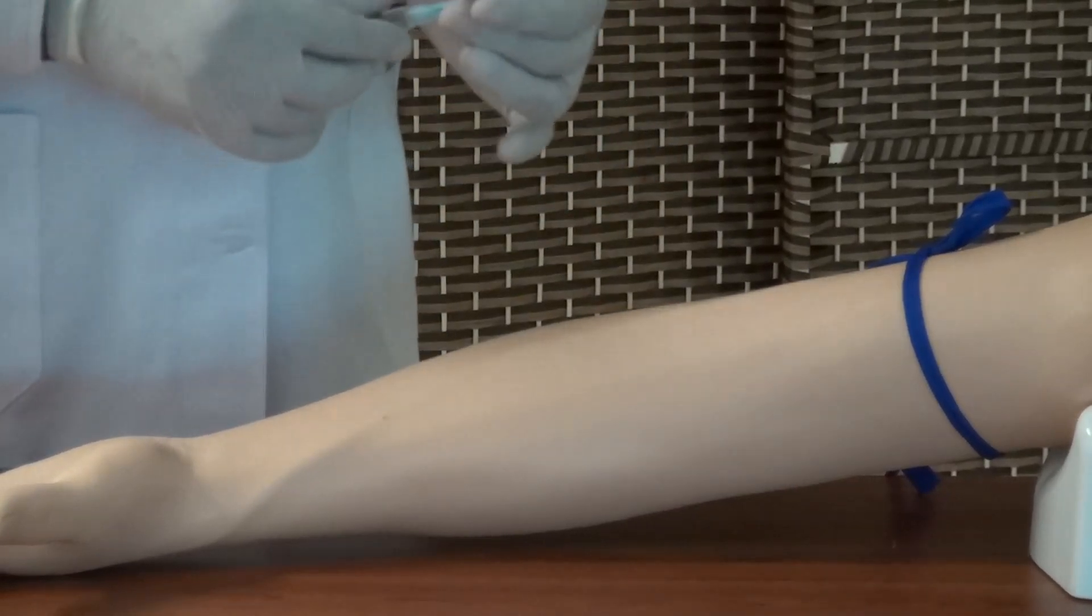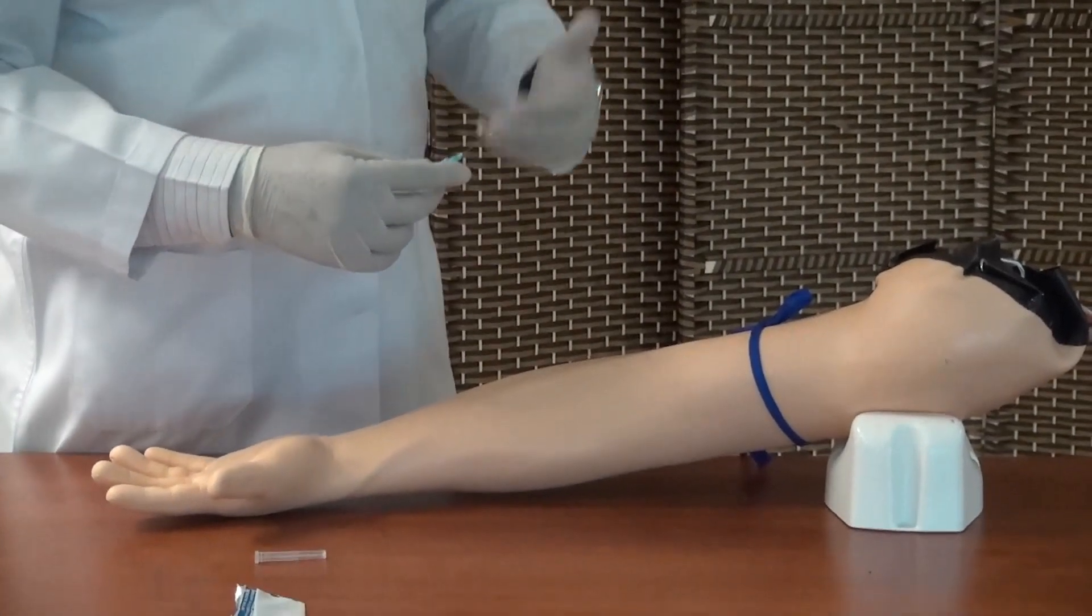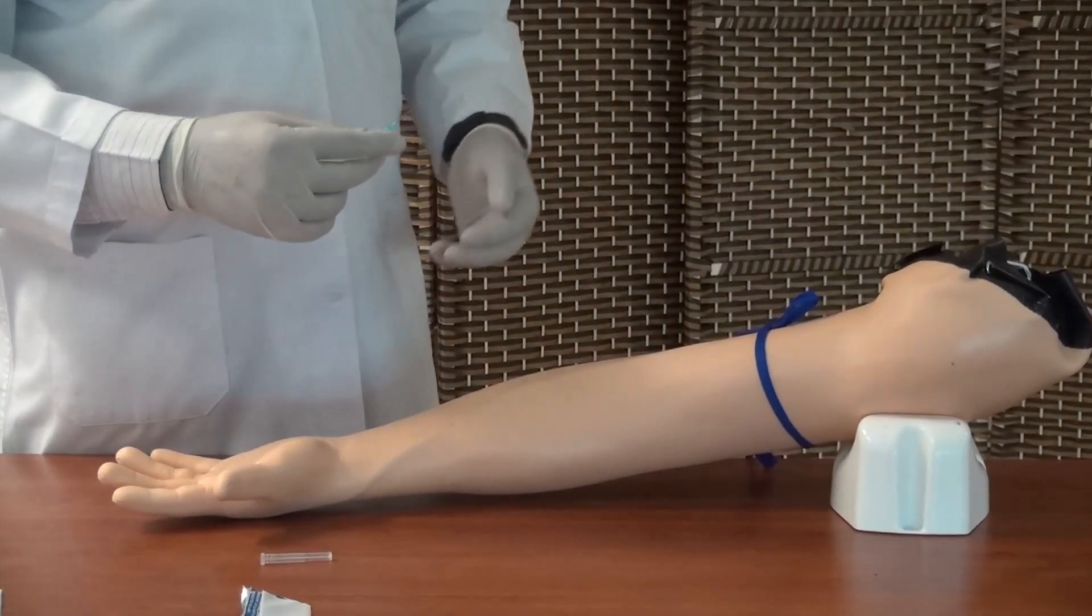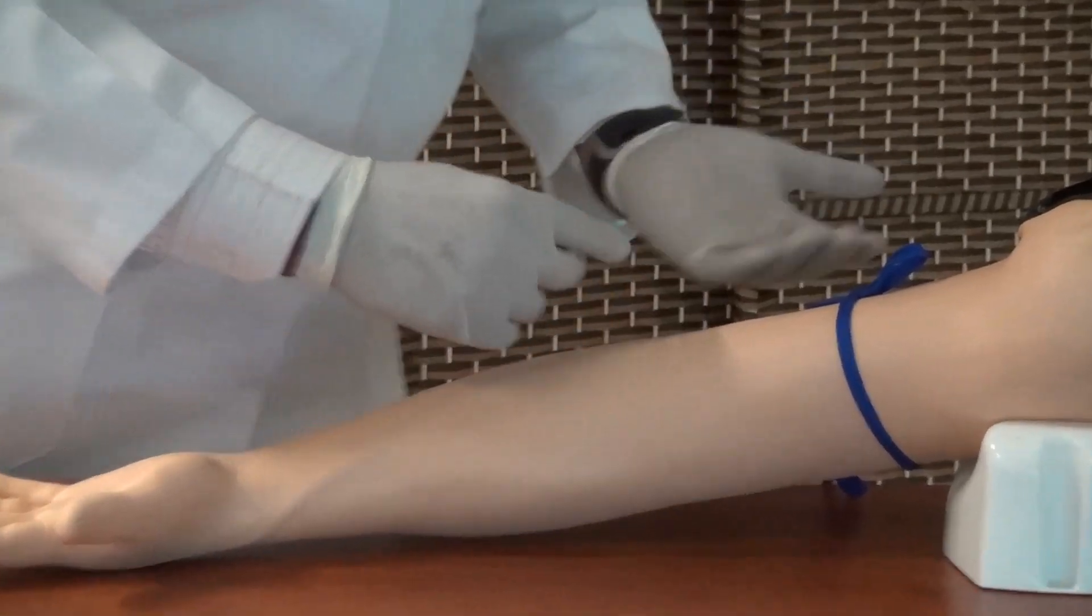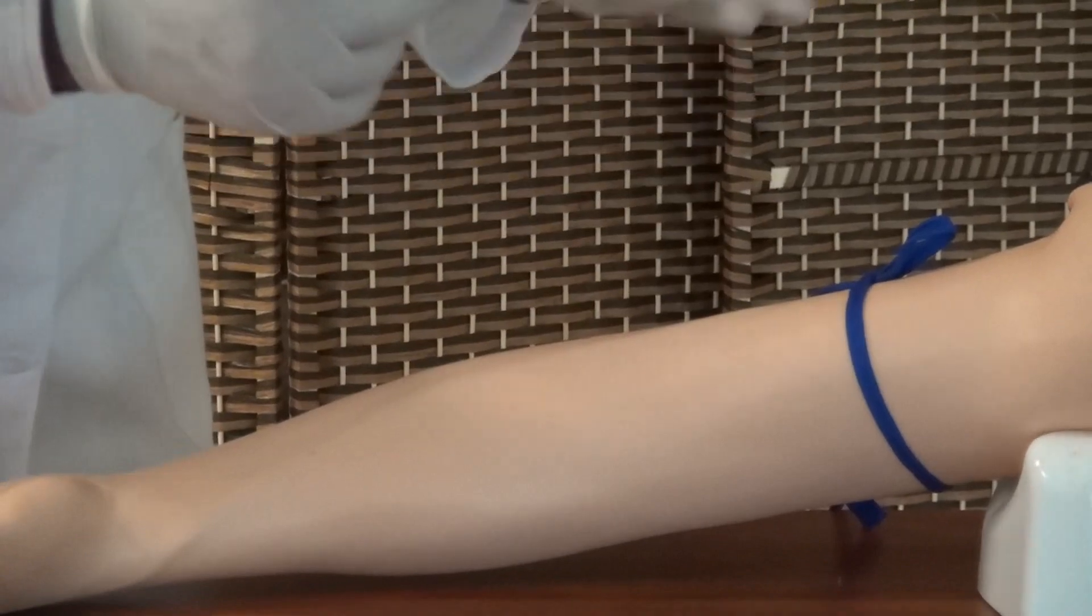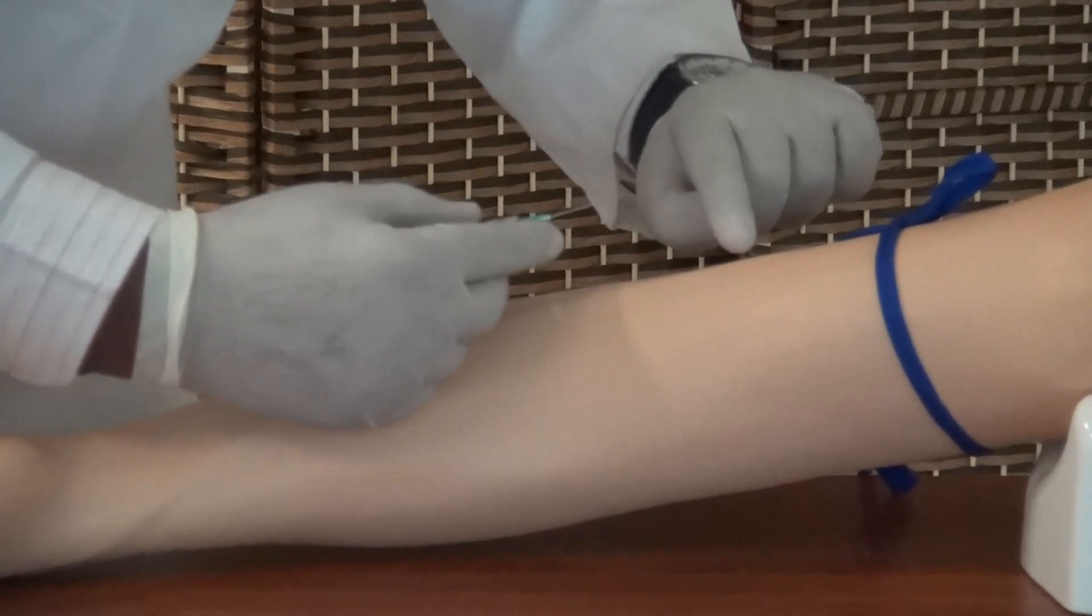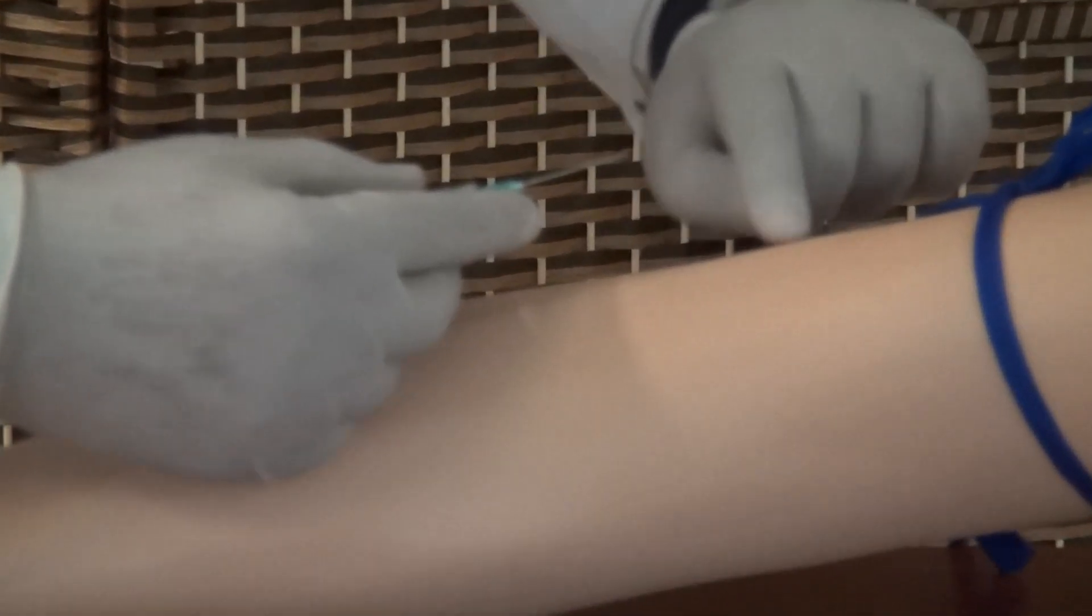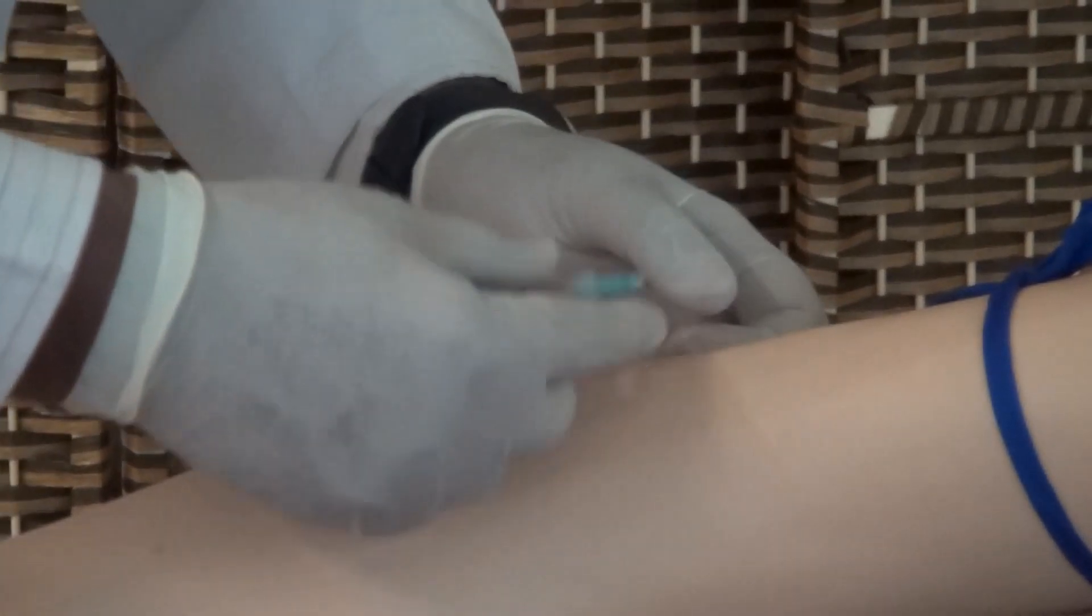I will again ensure there are no bubbles. Bevel always up. These are superficial veins, so you would enter at an acute angle, maybe around 20, 25, but less than 30 degrees. So here we locate, this is the point which I aim to get into. Here we go. Bevel always up. The cut part of the needle should be up.